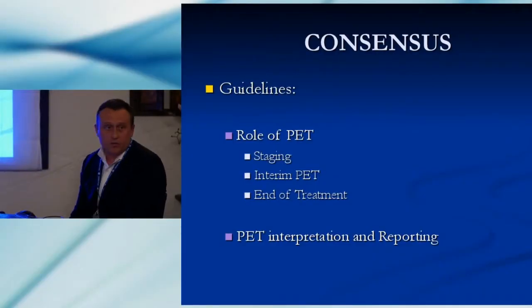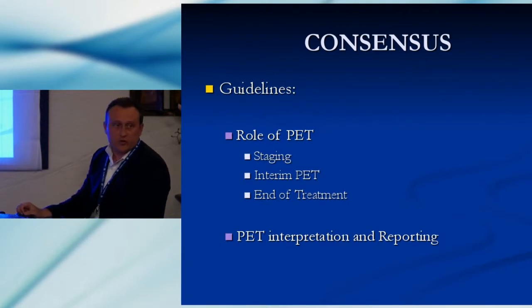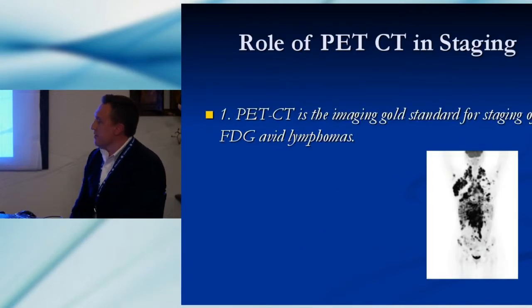The guidelines look at the role of PET in staging, interim PET, and also end of treatment PET, and also the way we should interpret PET and report it. So point one, the role of PET-CT in staging. PET-CT is the imaging gold standard for staging of FDG-avid lymphomas.